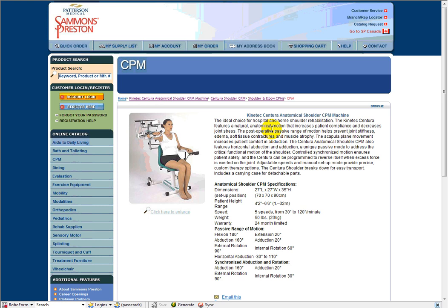More often than not, the physician would order a CPM shoulder. Now, knees bend pretty much two ways, forwards and backwards, or stretch your leg, and then bend your knee, and extend your knee.